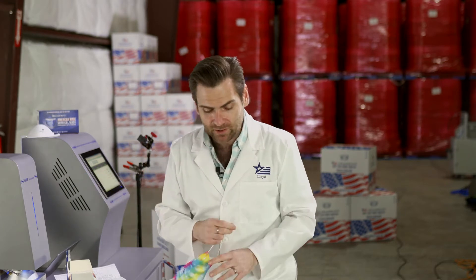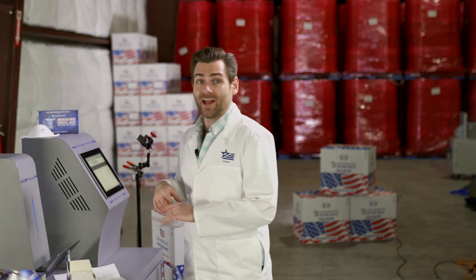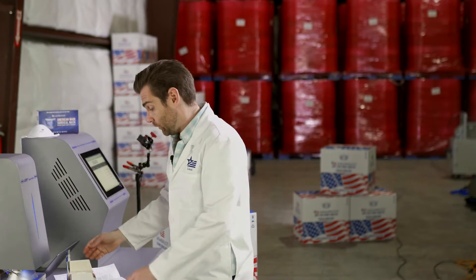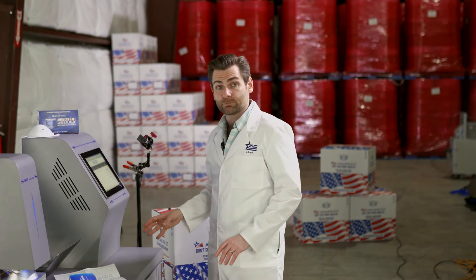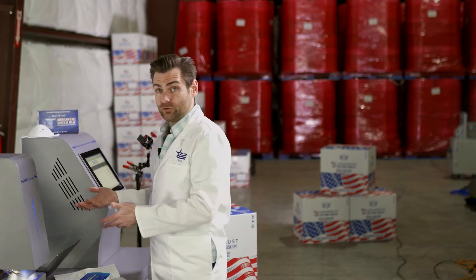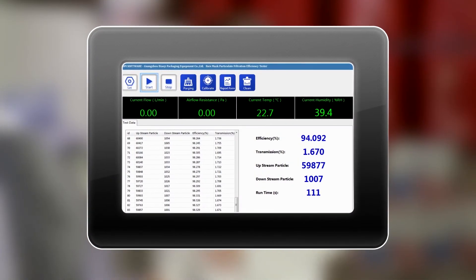The masks are really high quality, but I don't like how big the ear loops are. Your mileage may vary — maybe you get a fitter that makes it better. But does that matter? All that really matters is does the filter work, and that's what this machine is for. Their kids masks were at 94.5%, their last masks were at 96%, and this one is 20% less breathable — so usually that means higher filtration. But the result is 94.09% — worse than the kids masks.